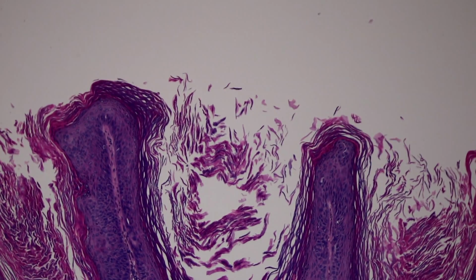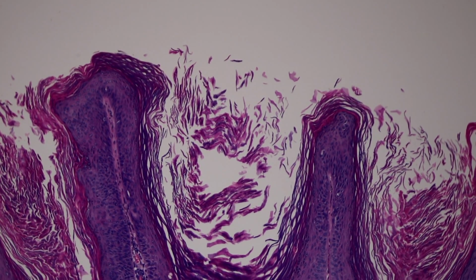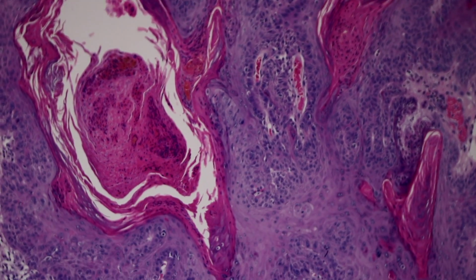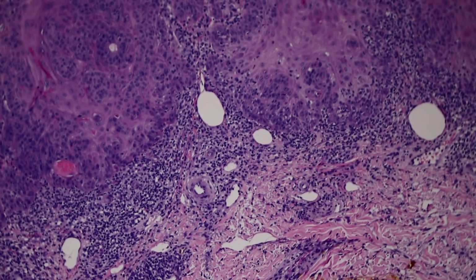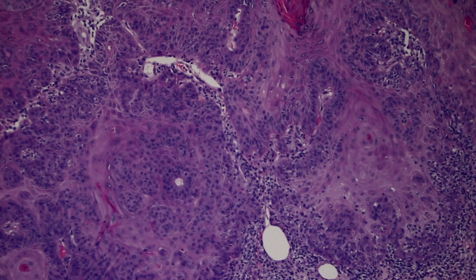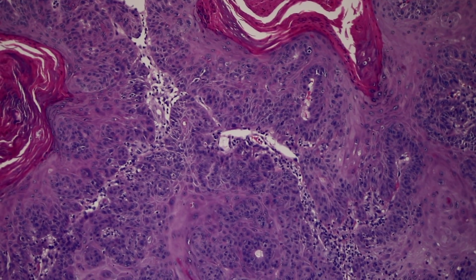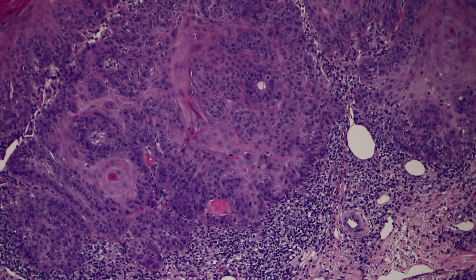I think I used this case as a picture in my Dermpath survival guide book because it really looks very warty, or maybe you could even argue that it's kind of a seborrheic keratosis appearance on top, but then go down deeper and what happens? Obvious atypia and invasive growth, and now there's no doubt we're dealing with squamous cell carcinoma. So I think you get the point: just be careful in superficially sampled keratinocytic lesions because they can really be treacherous and very much look benign even though there's atypia and invasion and malignancy down below.